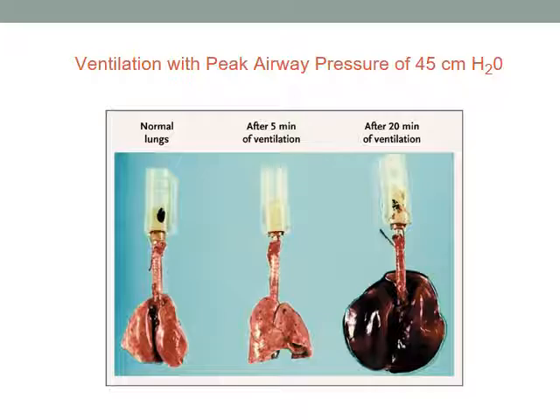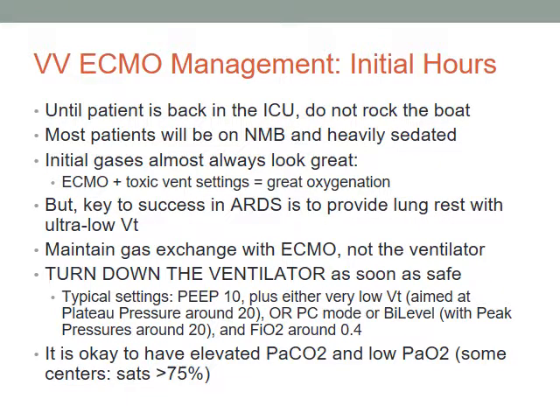So our whole goal here is to support the patient and turn down the ventilator, let the lungs heal up, and then hopefully get them off of their ECMO. So we'll start talking a little bit about management of these VV ECMO patients. And you've got the patient put on ECMO, and my philosophy is, until they get back to the ICU, don't rock the boat. We're not going to make changes in the ambulance. We're not going to make changes in the operating room. We're not going to make changes in the hallway.